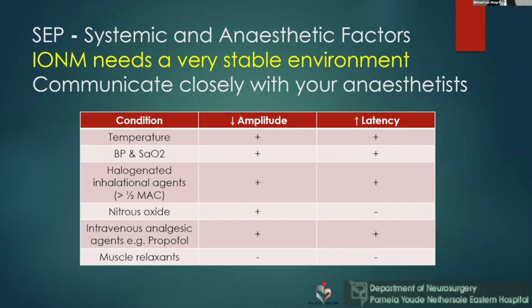Now after talking about the characteristics of the electrical stimulation, we'll talk about other factors that will affect the IOM. IOM needs a very stable environment, say for somatosensory evoked potential. We know that it can be affected by the temperature, by the change in blood pressure, change in oxygen saturation. Halogenated inhalation agents can also affect the somatosensory evoked potential. TIVA, the total intravenous anesthesia protocol, say if you use propofol, it can also affect the amplitude and the latency.